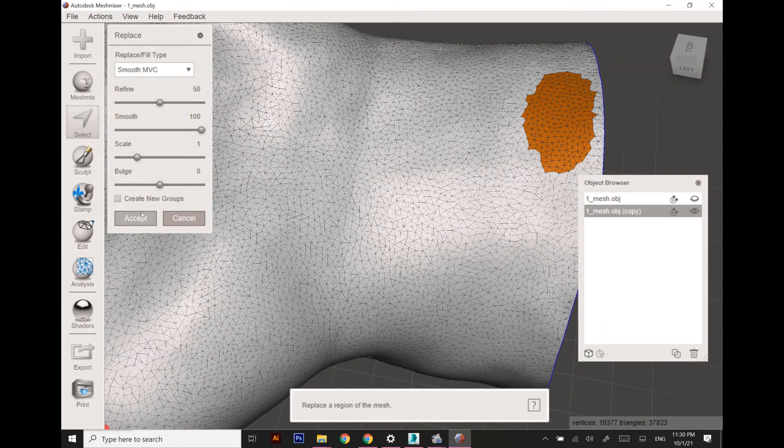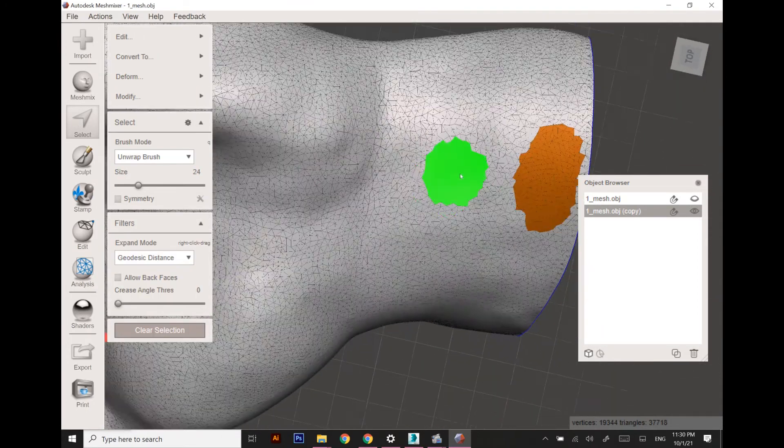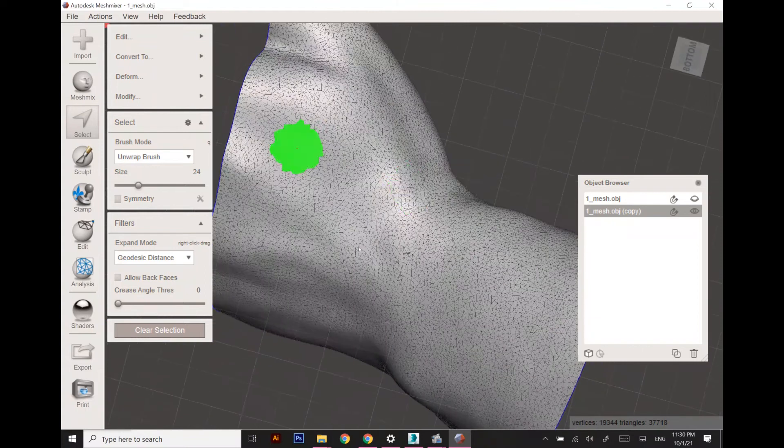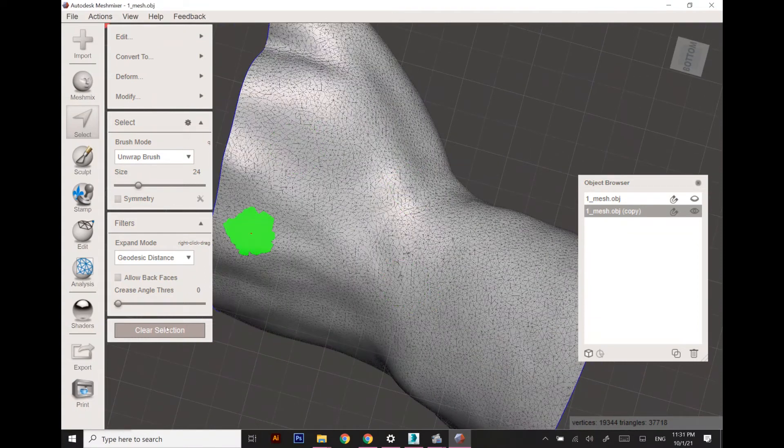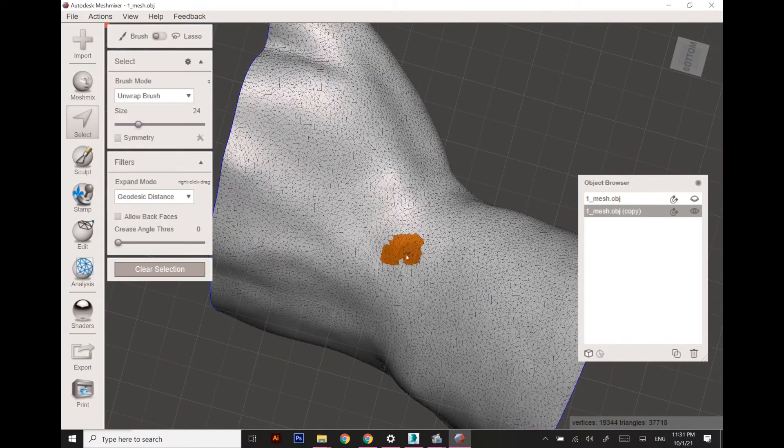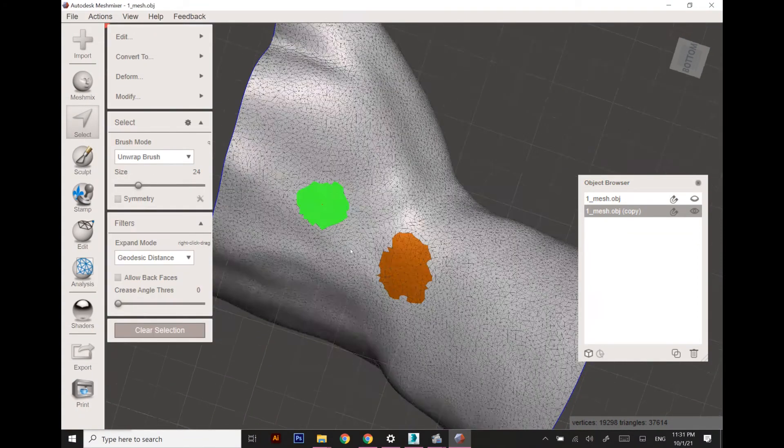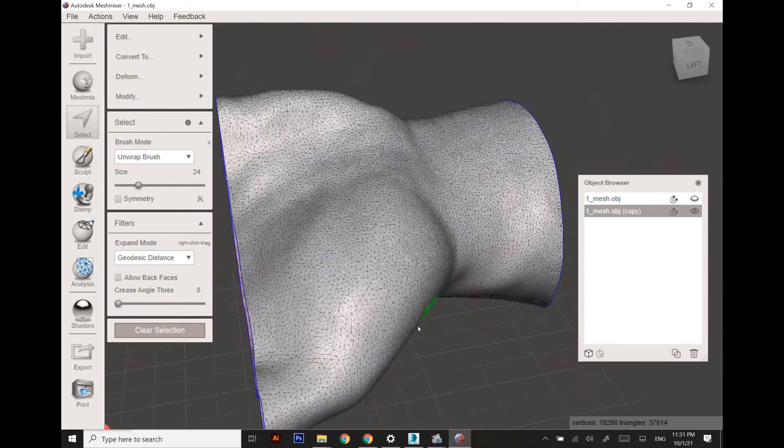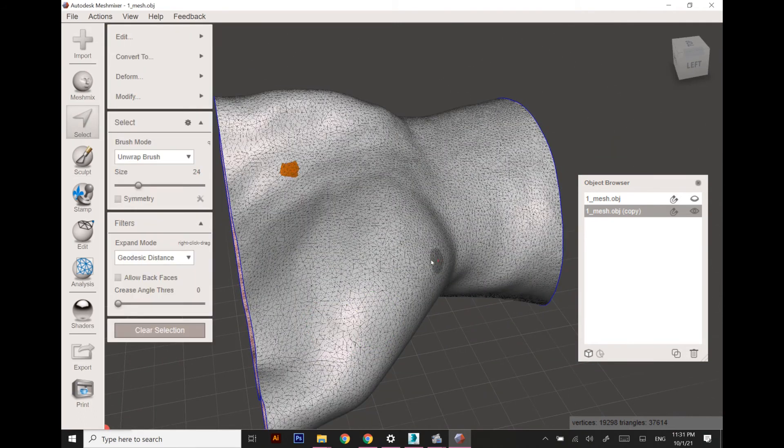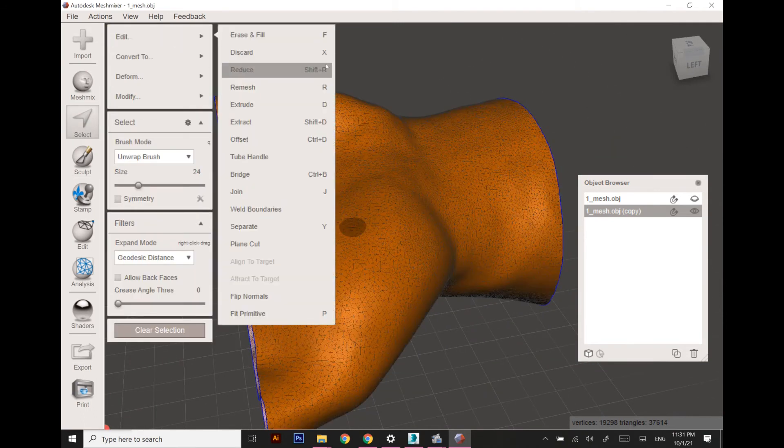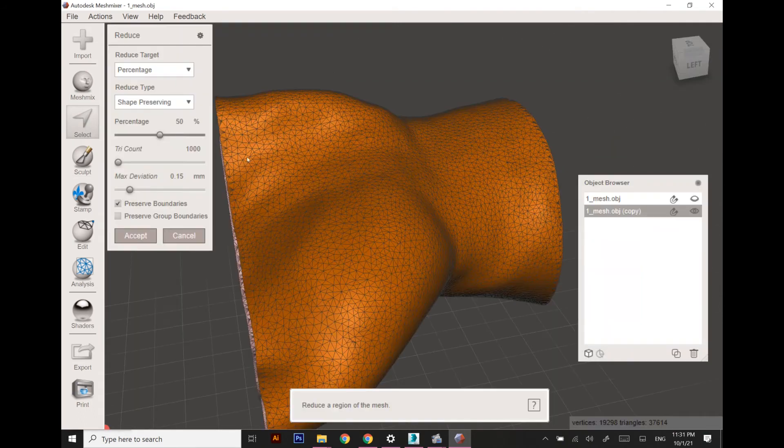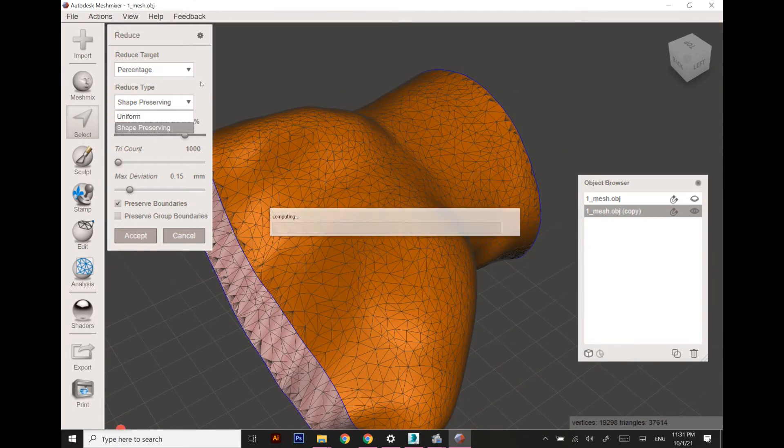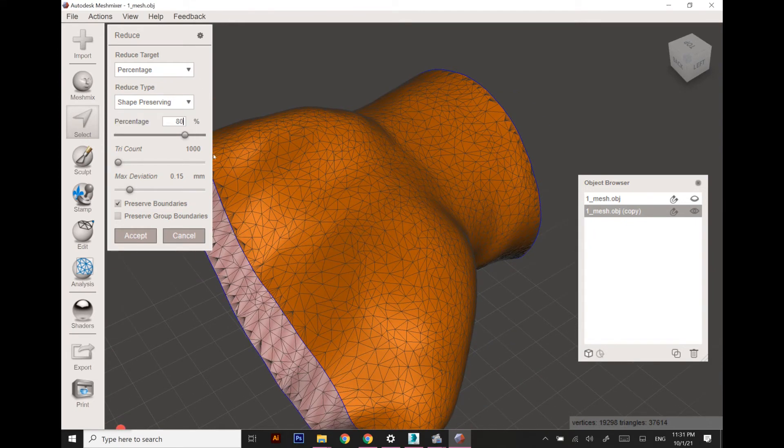There shouldn't be any non-distributed polygons. The polygons should be properly distributed, otherwise it will create a lot of problems. Once all the areas are rectified, I am going to reduce the number of polygons.